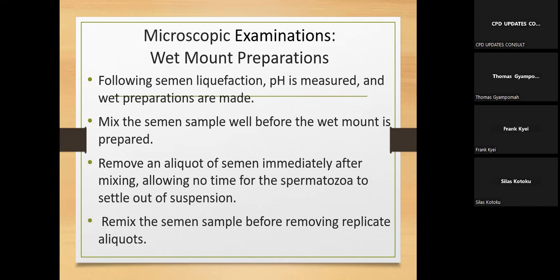What will be the depth of the suspension of the preparation under the cover slip? Yes, anybody to try it? Okay, let me go to the next slide. Is anybody trying it?